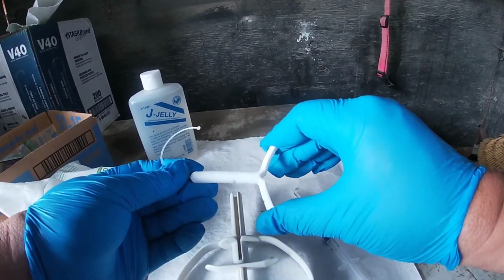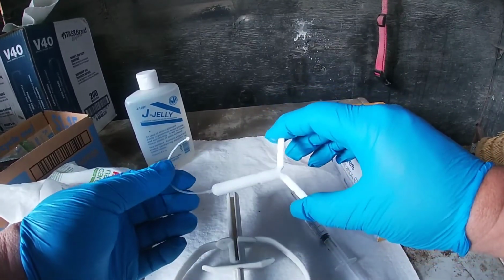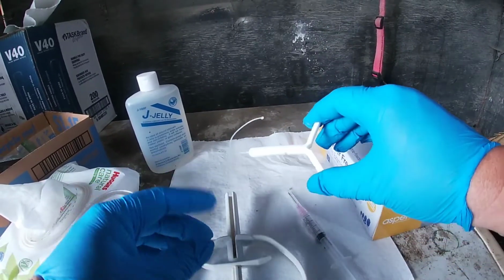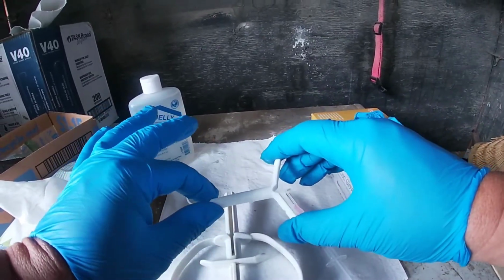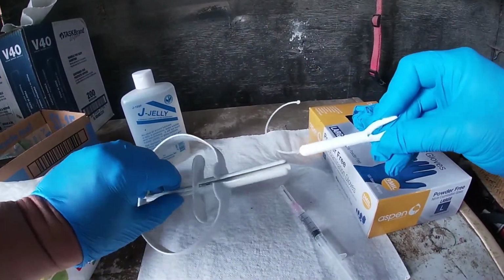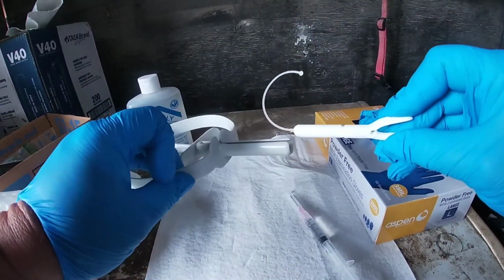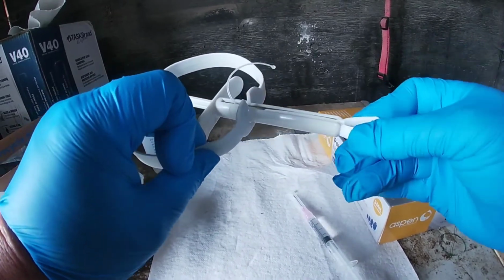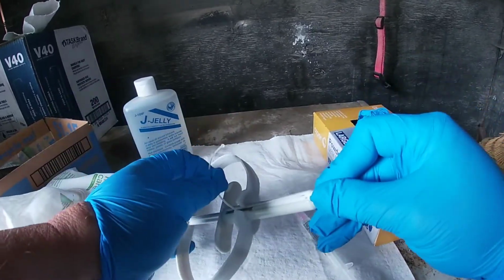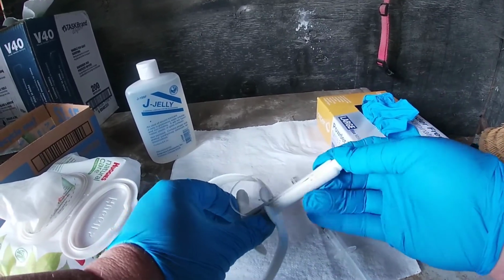They are kind of hard. They're not soft like you would think, but they are impregnated with a progesterone to tell the doe that she's actually pregnant. So that's why she doesn't come into heat until this gets pulled out. So to load this, you'll see this little insert here. That's where the string goes. And you put that in there so that the string is out. I'm having a hard time putting that in there, but yeah, that's how it goes in.